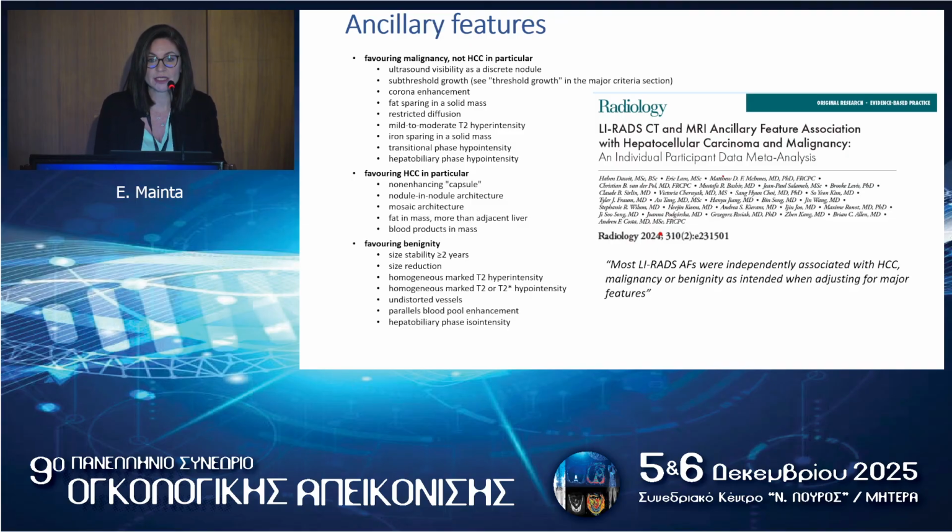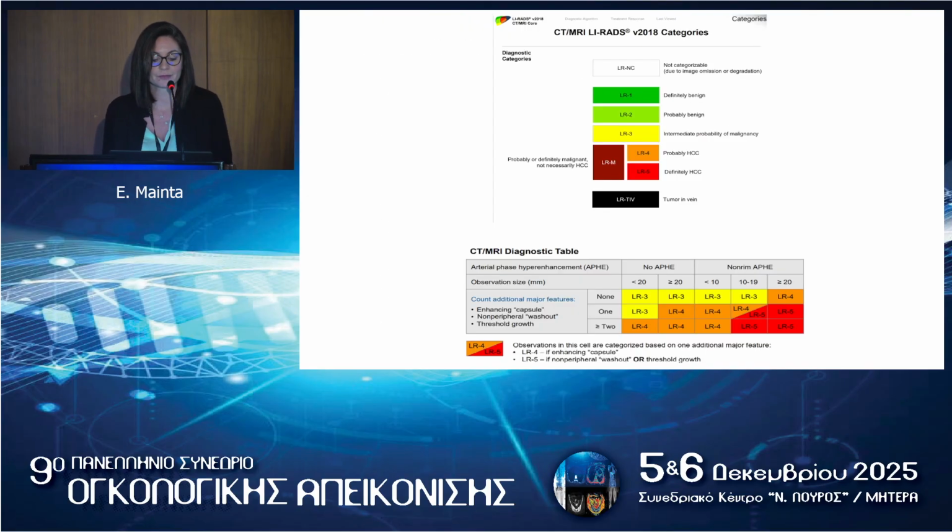This is a very interesting meta-analysis. This was published in 2024, and the team showed that most LI-RADS ancillary features were independently associated with HCC, malignancy, or benignity, as intended, when adjusting for major features. We all know these 2 tables. This is the 2018 edition.